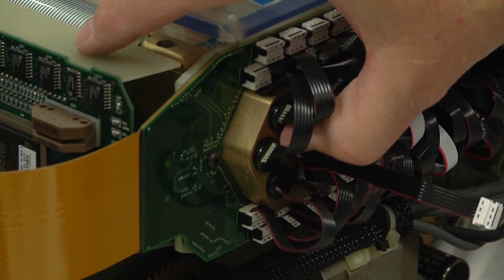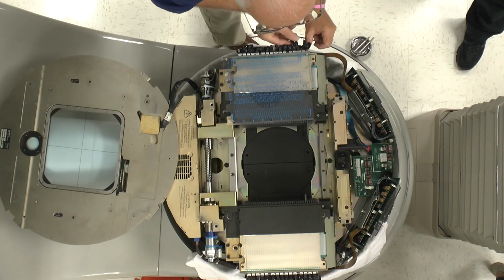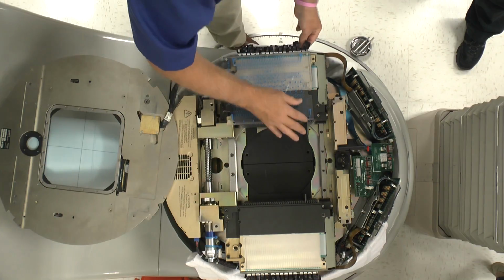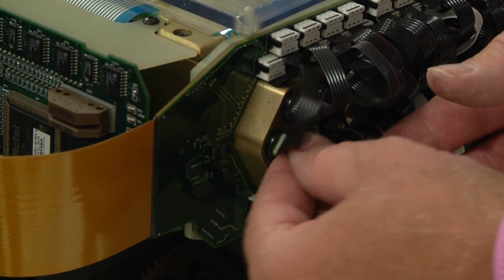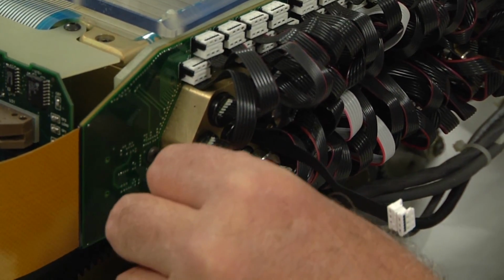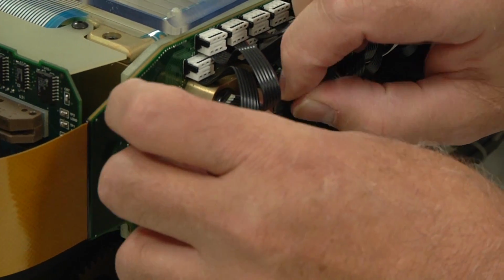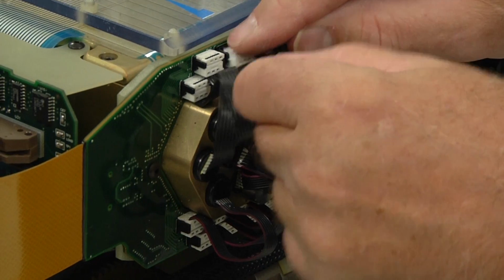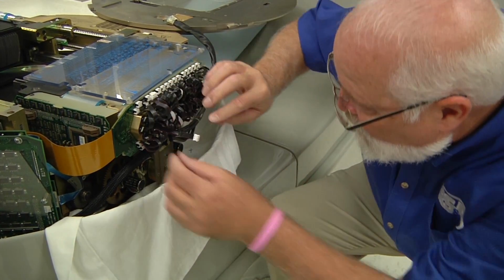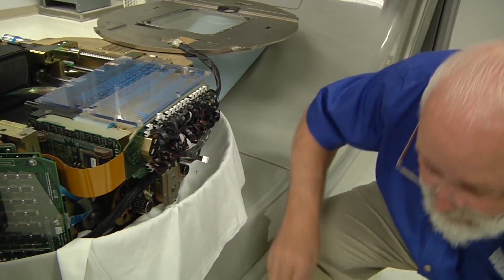Okay, so it's springy. I know I'm in there. And if I want to make sure, I can start rotating the motor, and you'll see the leaf move slightly. It's moving, but you've got a lot of turns before it'll move a millimeter. So now, to put the screw on, even though this is the one I replaced, these others may have moved, so I need to make sure that they're all springy. Let's see. Okay, so now I know that they're all in the proper position. I can put the screw nut back in.